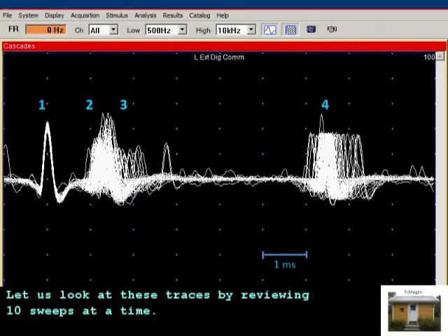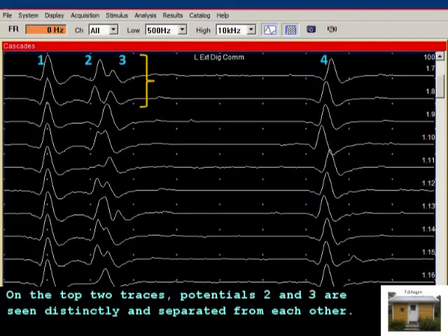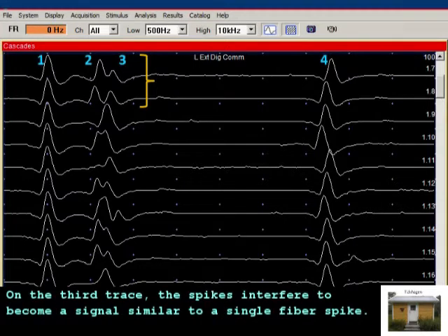Let us look at these traces by reviewing 10 sweeps at a time. On the top two traces, potentials 2 and 3 are seen distinctly and separated from each other. On the third trace, the spikes interfere to become a signal similar to a single fiber spike.